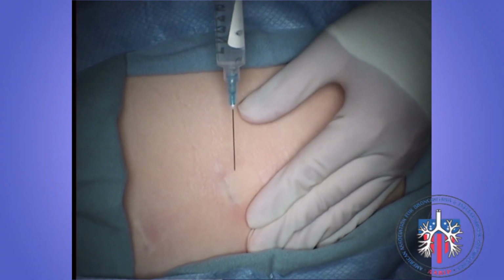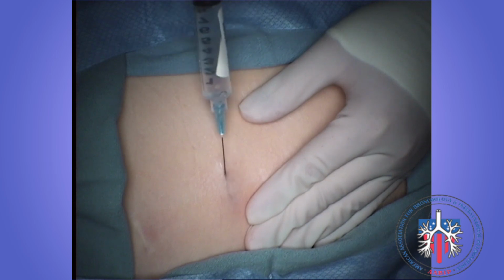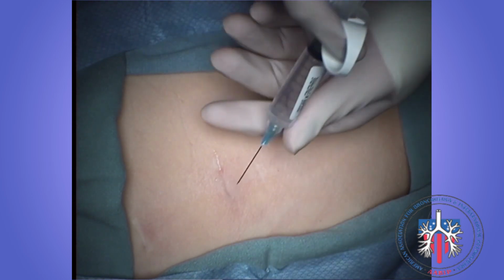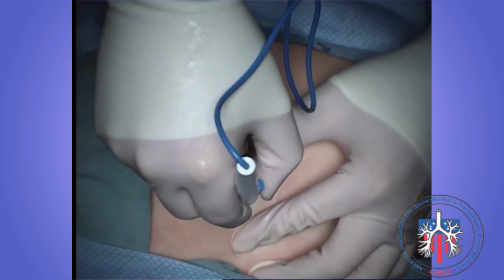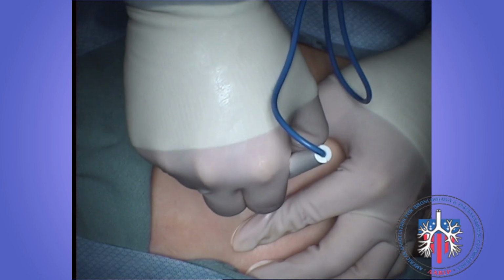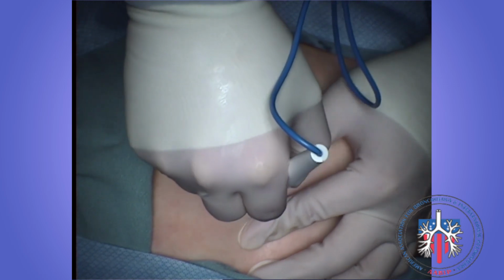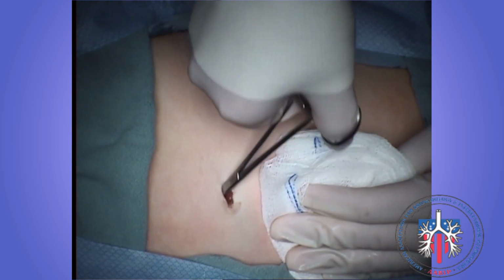Once the entry site is confirmed and marked, we inject local anesthesia to the entry site. Confirmation of entry site is gained by aspirating fluid with a finder needle. Once anesthetized, we use electrocautery to provide a 1 to 1.5 centimeter incision, then enter the pleural cavity with a combination of electrocautery and mechanical dissection.